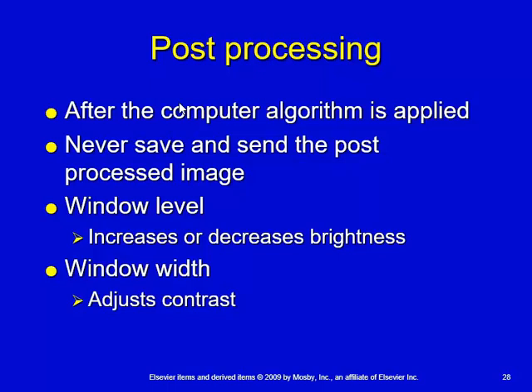You want to save the original and send that to the radiologist. If you happen to save a second one and send both of them to the radiologist, that's fine, but never send just the post-processed image to the radiologist. Always send the original. If you send them both, that's okay. So window level increases or decreases brightness, as opposed to width, which increases or decreases contrast.